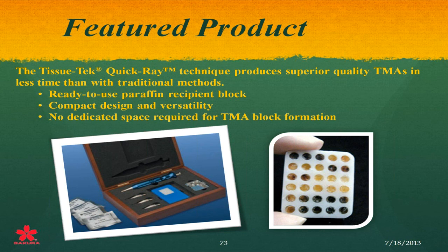Wanda, I do have a question for you. One of the questions is, what do you recommend for storage of pre-cut positive controls? Well, Alicia, most of our controls are stored at room temp. The only ones that we keep in the refrigerator, we keep the Pin 4, we keep the breast panel controls in the fridge, but everything else we keep it at just room temp.